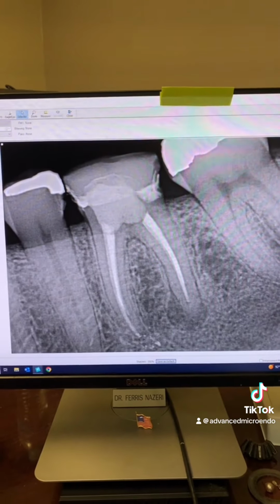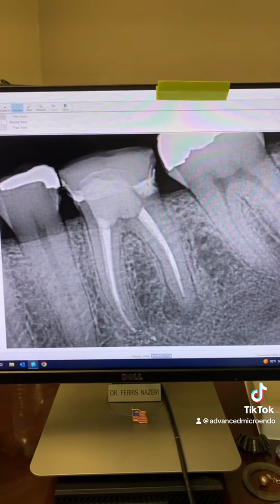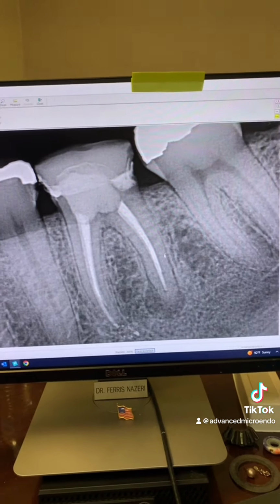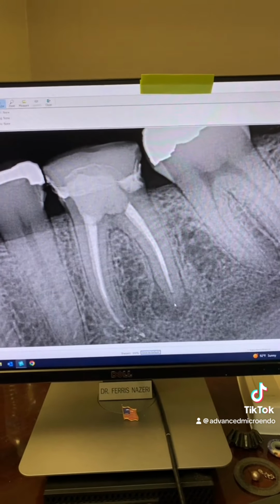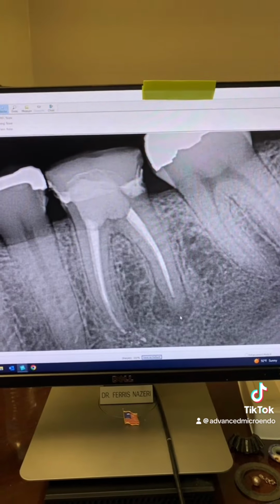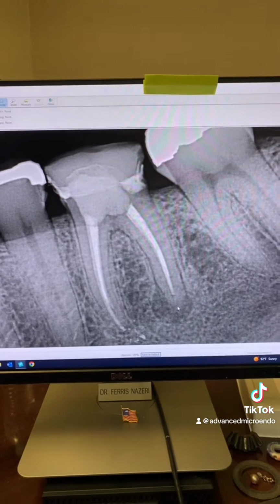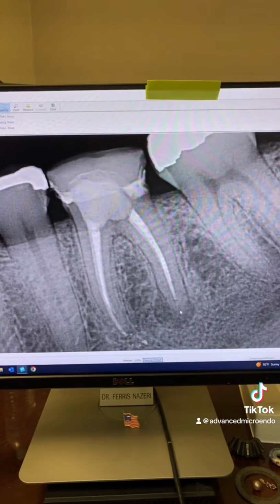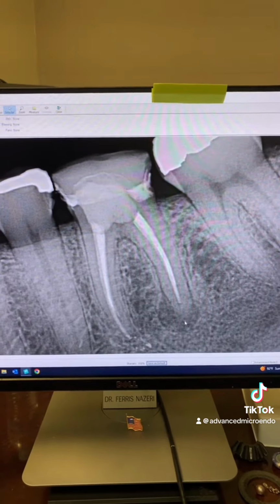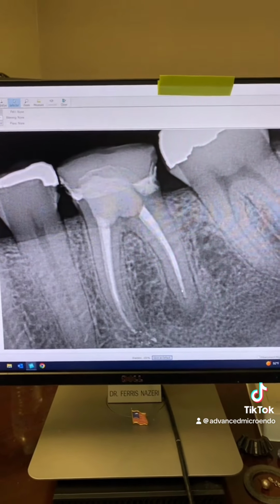And, well, I don't need to take a CBCT because I can read PAs. Take a look here. Of course, the reason for the infection is not because the obturation is short. The obturation is short and there's a problem, but the reason for the infection is microorganisms, bacteria in the space. So this dentist left necrotic tissue and bacteria behind. Bacteria is what's causing the infection, not the short fill.